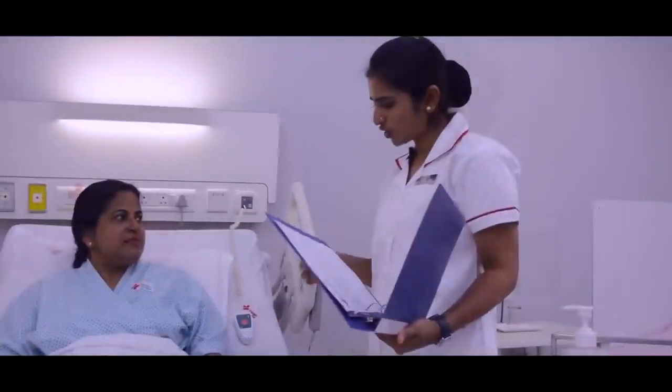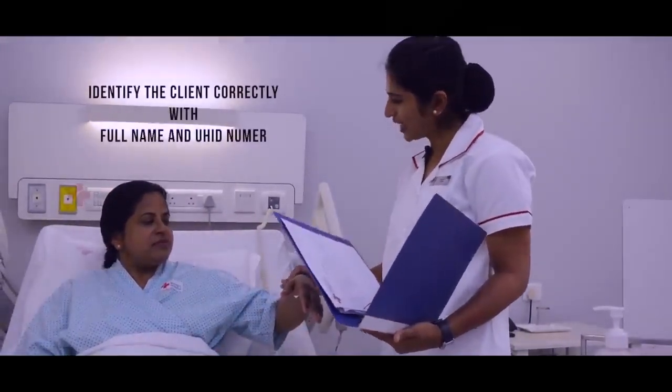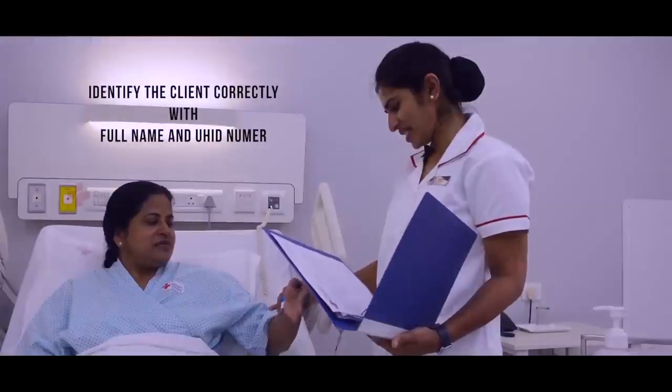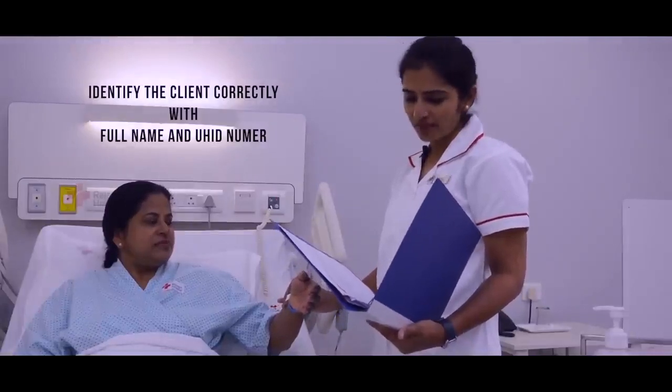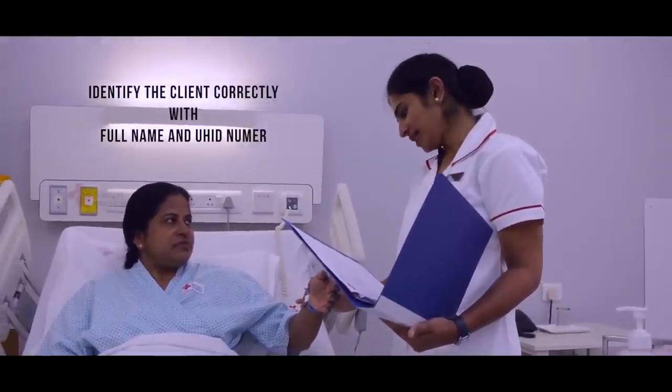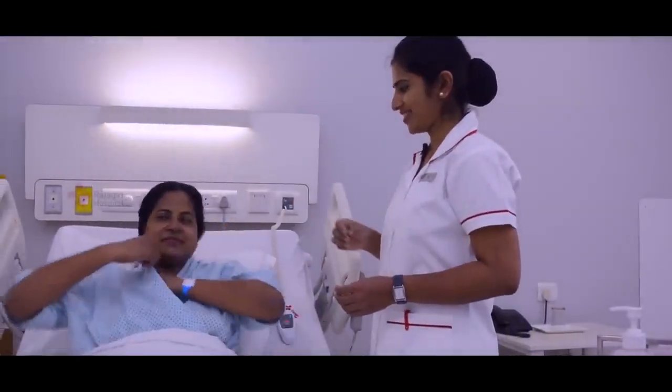Okay, sister. Ma'am, please show me your ID tag. Okay. Ma'am, please tell me your full name. I'm Anjali Biju. Okay, Anjali Biju. UHID number is 1818 1818 1171. Okay, that's fine. This one is to wipe your armpit.